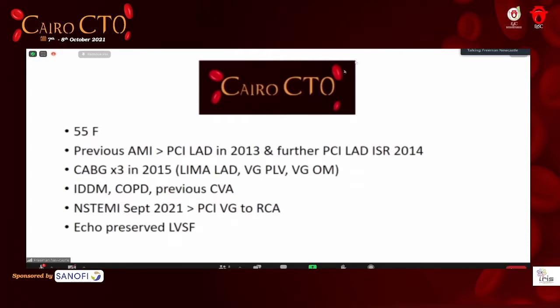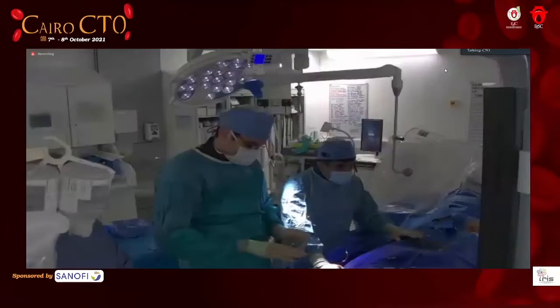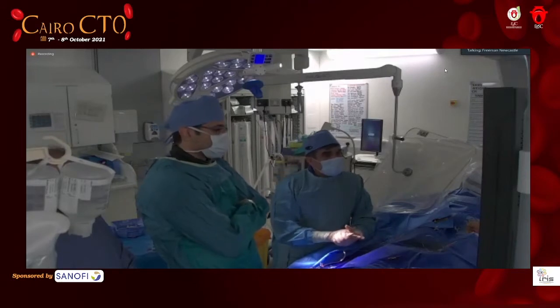Any comment before I show you the angiogram? We cannot see the video. We don't know the segmental wall or viability and things like that. Normal LV. She had a normal LV in September, about a few days ago.